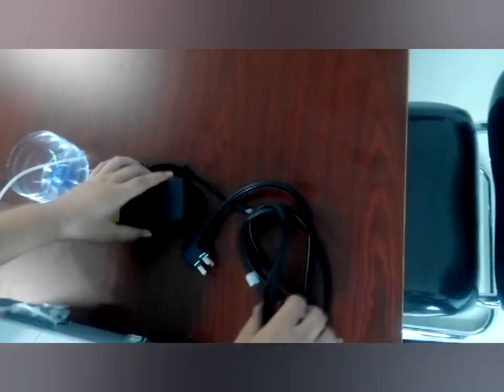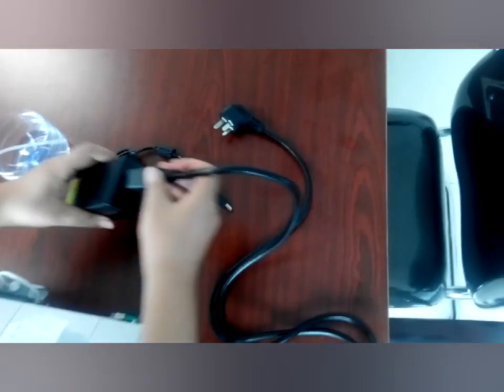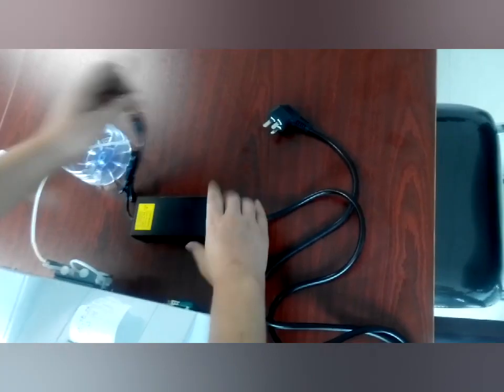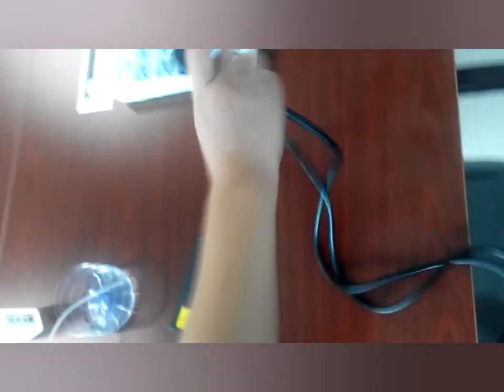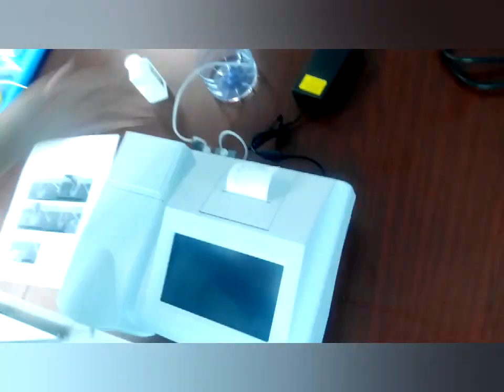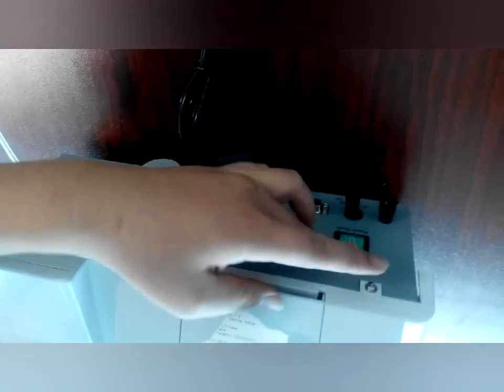Then we should connect the power. This is the plug which fits your market. We should connect it with the power adapter — one side connects to the machine and the other side connects to the power. Finish this, then just turn on the power switch.